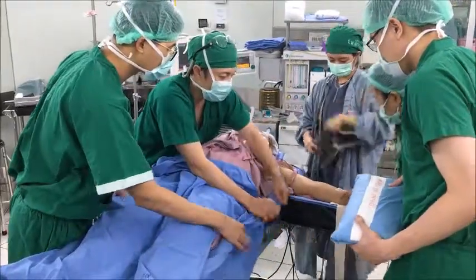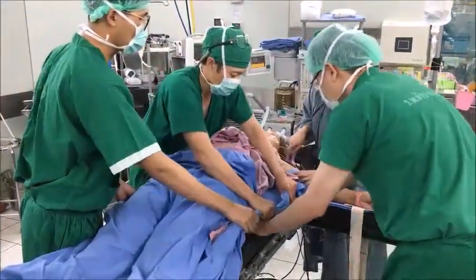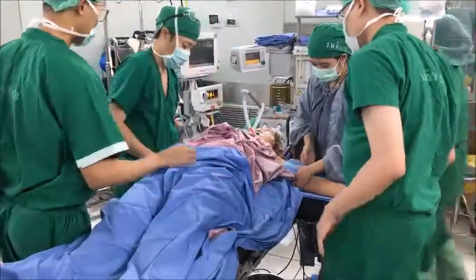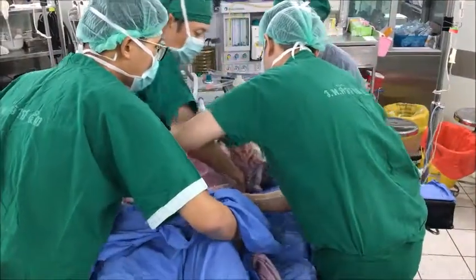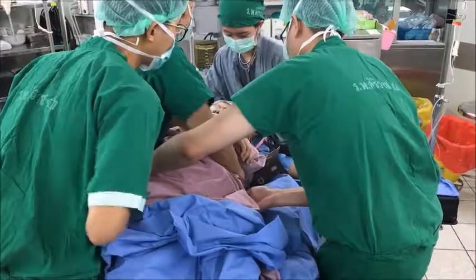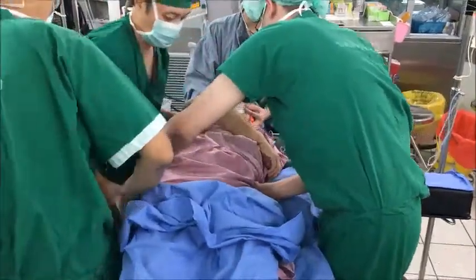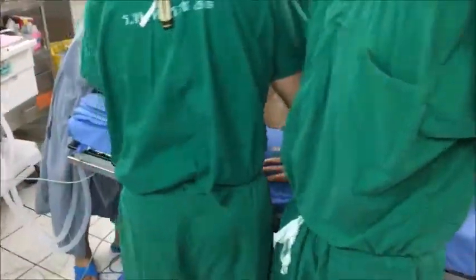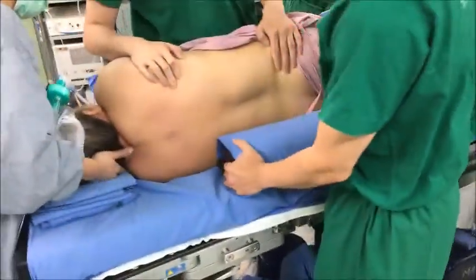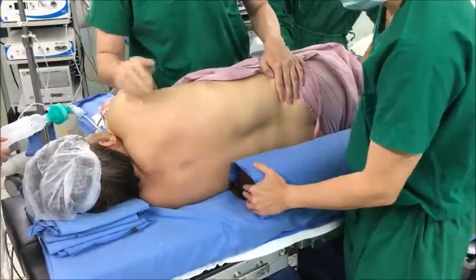The non-operative side of the patient is turned up and the sandbag is inserted underneath the buttock. The patient is moved to the operative side and aligned on the edge of the operative table. Next, the patient is turned onto the non-operative side. The spine pillow is inserted below the inferior angle of the scapula on the site of operation.